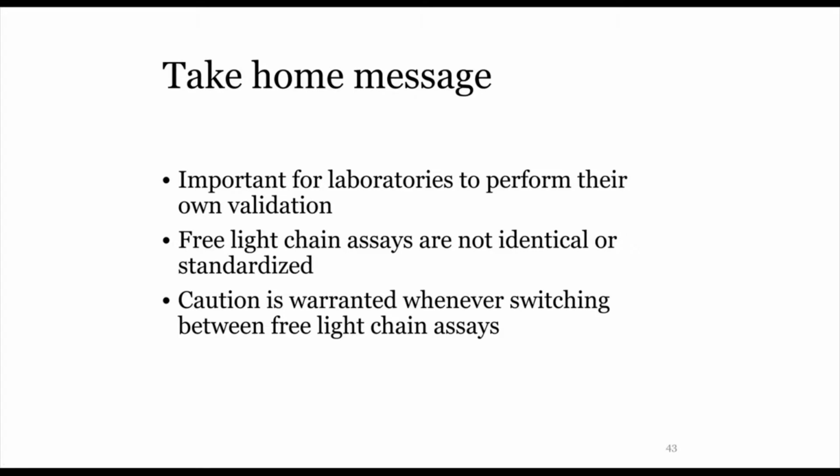Dr. Murata, can you elaborate more on the conclusion point that says further dilution may be required even when the instrument gives a numerical result, as the resulting number may potentially be falsely low? Does this mean there are issues with antigen excess?